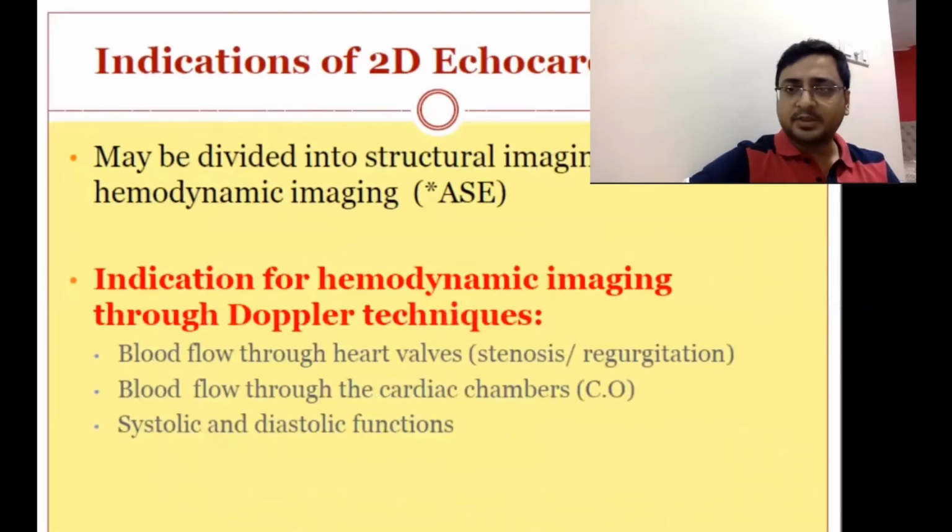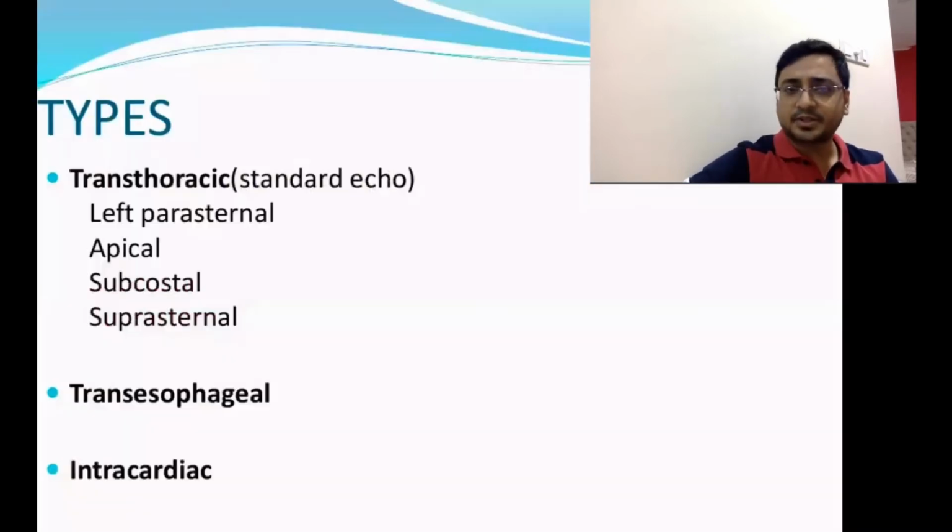Within the hemodynamic images, we can assess the blood flow through heart valves, the stenosis or regurgitation, its severity, blood flow through cardiac chambers, systolic and diastolic functions.